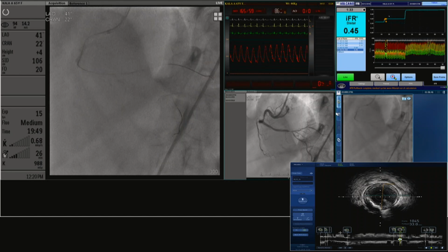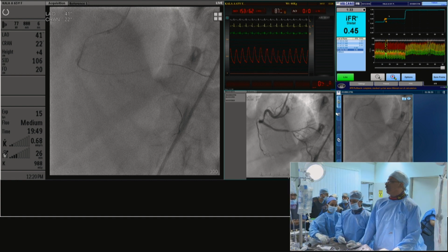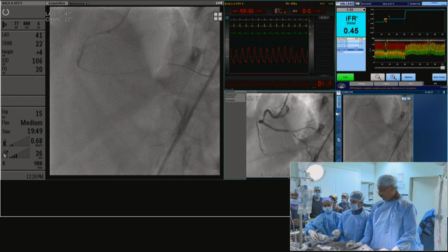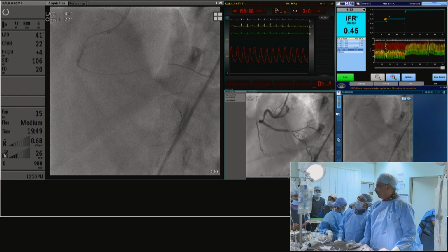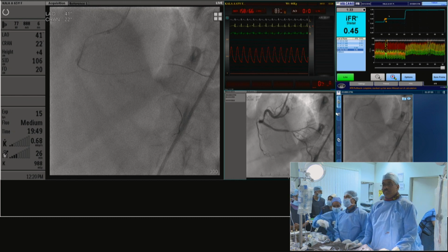While we're demonstrating great stuff on imaging, we also have to put it in the perspective of daily clinical practice, without everybody believing that these cases can only be done with imaging or without imaging. In reality, all of us who are image conscious, even in the best of the centers, only image 25% of our patients.